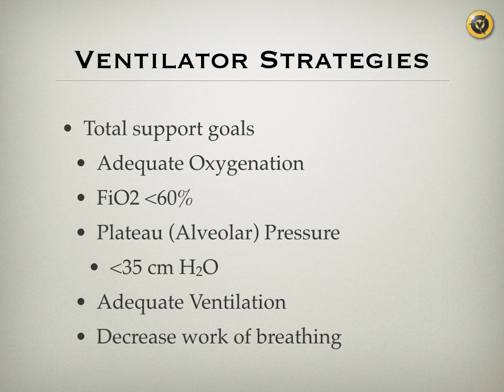And also, we know from the studies done earlier that if you use a plateau pressure of more than 35 centimeters of water, and some people would like to use 30, then you're destroying normal lung elements, and hence you are shooting yourself in the foot. If you have inhomogeneous disease like ARDS, and you have some lung that is normal and some lung that is diseased, the pressure will actually destroy the normal lung if you go above 30 centimeters of water. So you want to reduce your plateau pressure as much as you can, and then you want to make sure that CO2 is normal.